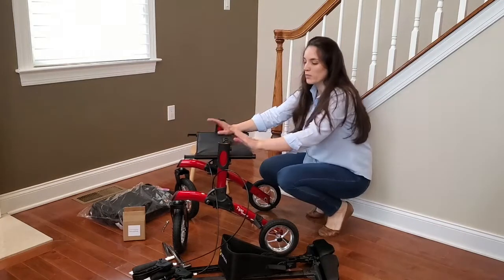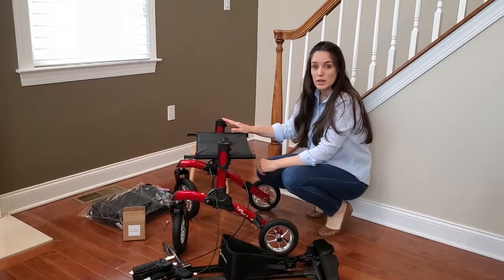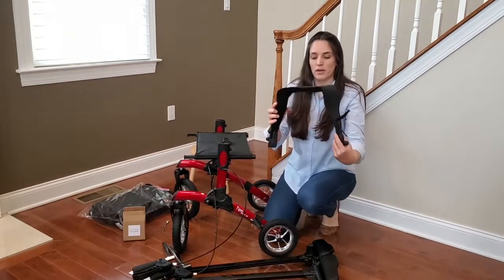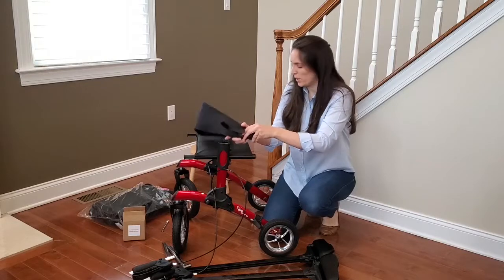Now we're going to get ready to insert the handles and the arm support. First, you need to make sure that you put in the backrest. So here's what you do: get the backrest, make sure that it's oriented right, and turn the little knob so you open it up on both sides.